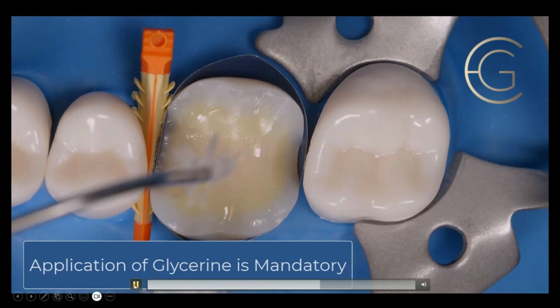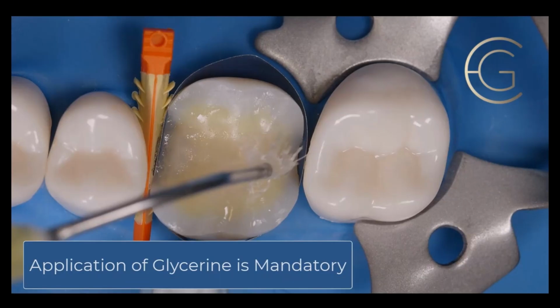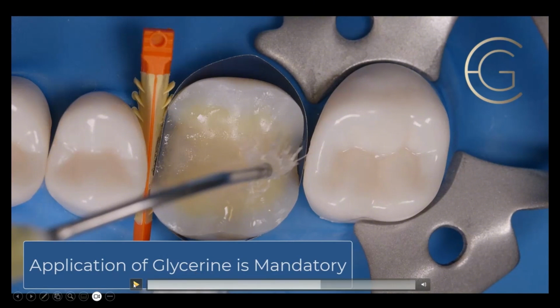Now, this part right here is critical. Please write this down. After you've cured this, you have to apply glycerin. Some people use KY jelly, some people use Liquid Strip. There's all kinds of different things you can put on there. And the problem here is if you don't do this and you go to make your temporary, it's now a permanent temporary. It locks on because you have 30% uncured resin on any composite restoration.